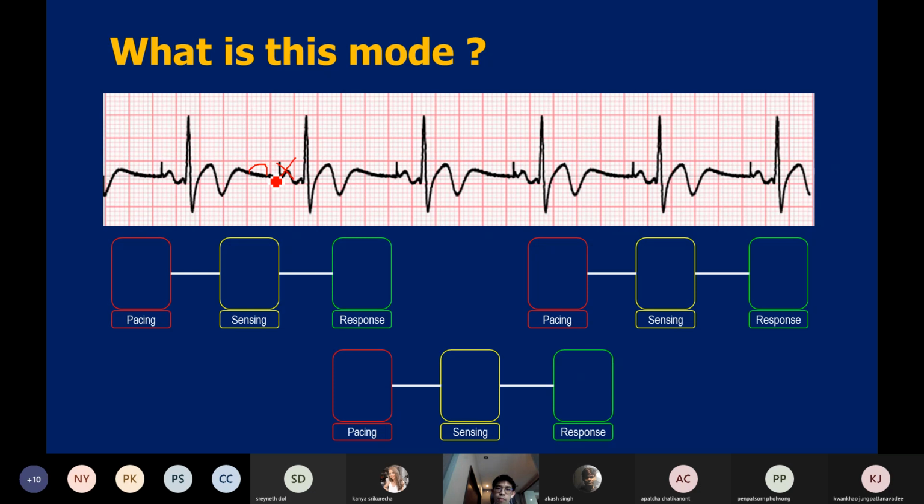And if it senses an abnormal electrical signal coming, right? So it will evaluate that signal and will trigger the normal signal, right? You mean the abnormal signal, like it's not from the heart or something?